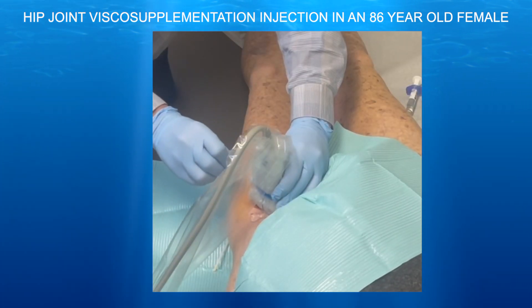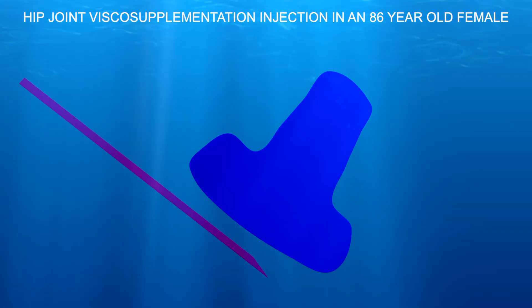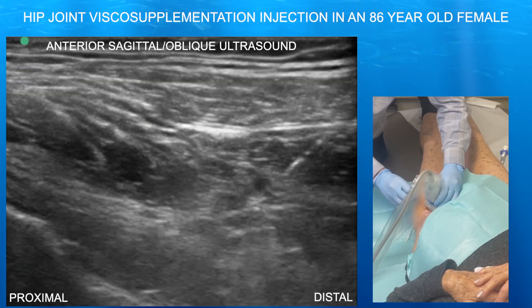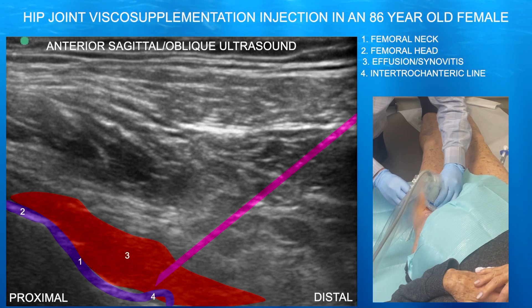So here we're going in. We're heel-toeing the probe, trying to make the probe as parallel to the needle as possible in order to visualize the needle as best we can. Here we can see the needle is essentially going right into the femoral neck, into that anterior recess.